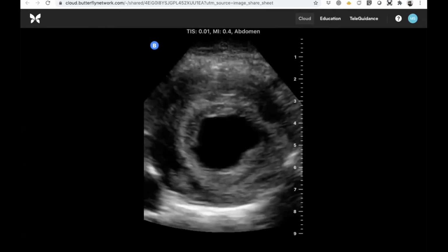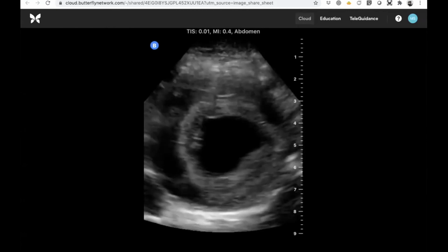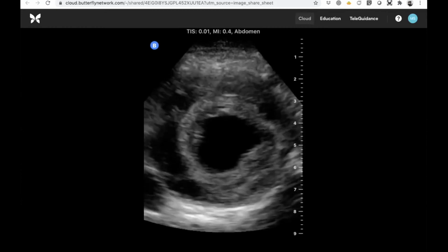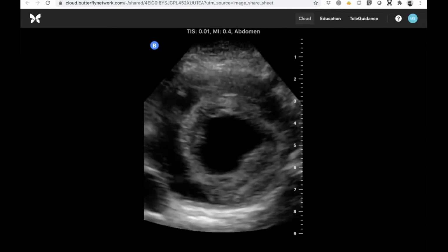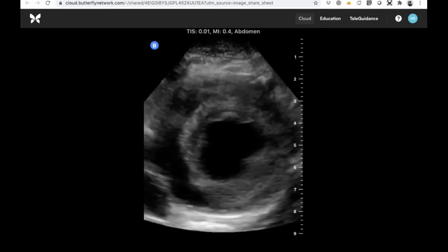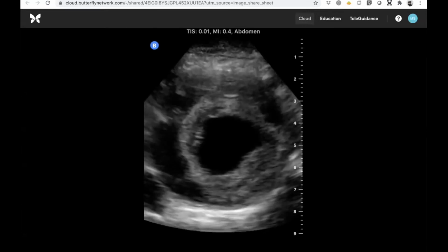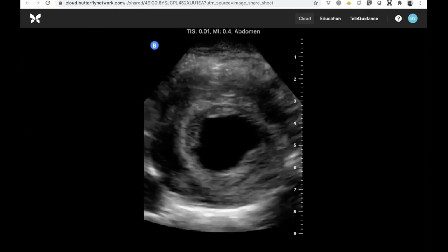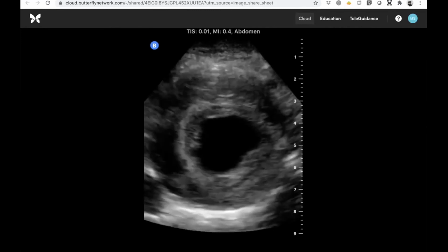The other issue is, we're back to my philosophy of anchor image, where you have in your mind already, if I could see the vertebral body deep to this thing and a shadow coming off of it, that's the image you have in your head of what an aortic aneurysm should look like, and what a normal aorta should show is that vertebral body with shadowing underneath. So more depth, always a good idea when you're first starting a scan. I always tell new learners, start with way more depth than you think you need. And then once you're sure that you're looking at what you're looking at, decrease that depth and fill the screen with the object of interest.